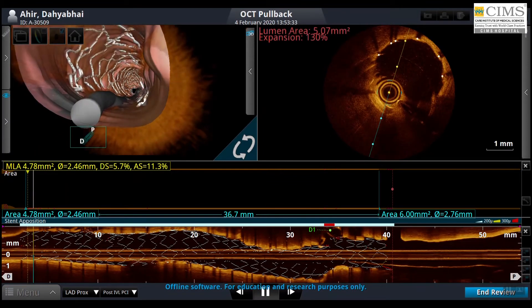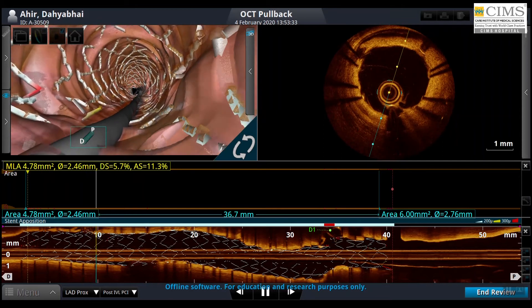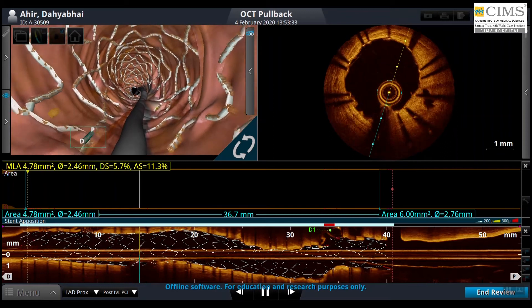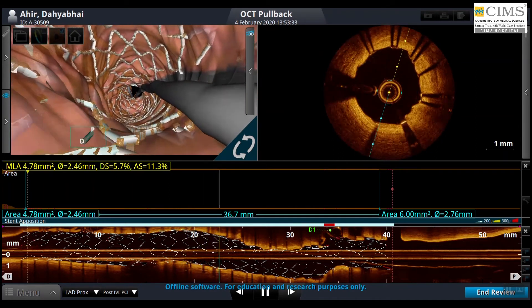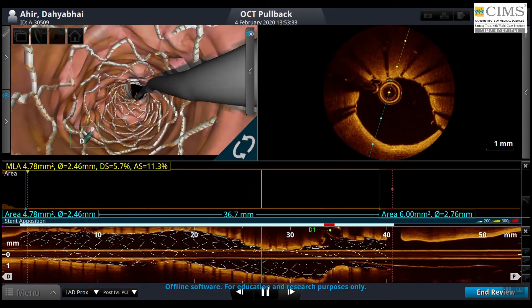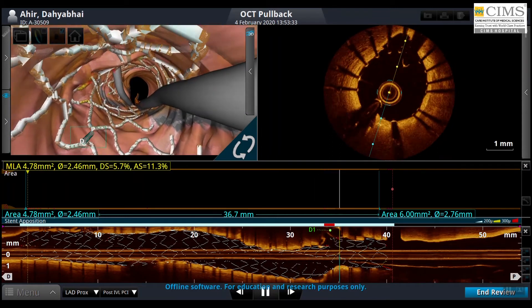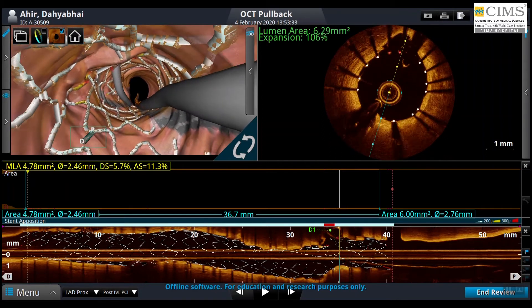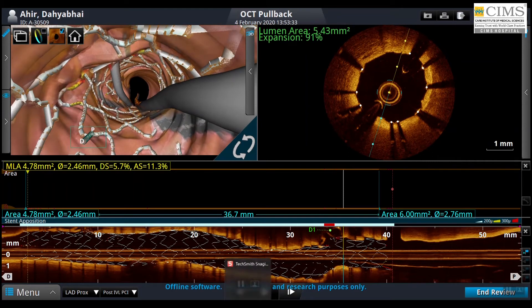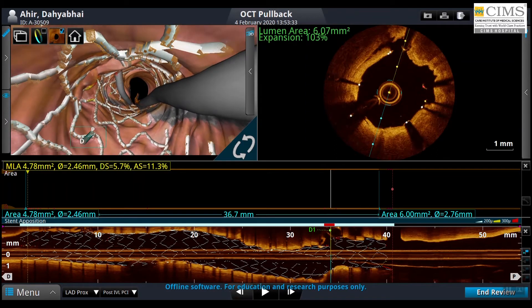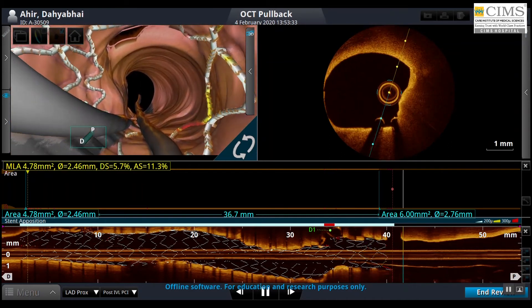We perform another OCT run after deploying the stent. The fly-through stent image on OCT shows the stent struts with a well-opposed, well-implanted stent, no areas of malapposition, and no areas of edge dissection at either the distal or proximal end. Importantly, at the point where the OCT passes one of the major diagonal branches, there is a dissection flap extending into the ostium of the major diagonal. That is where the problem lies and where the diagonal appeared to close off. The decision was therefore taken to place a second stent at the ostium of the diagonal using a reverse T technique to salvage that major diagonal.